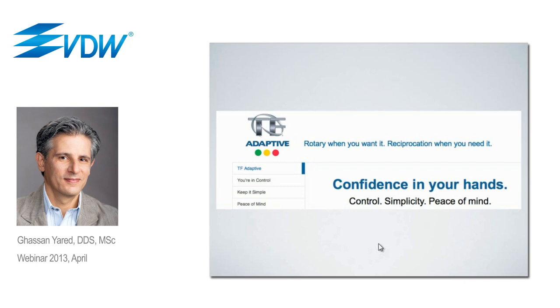But also, according to Sybron, in this system, reciprocation is used when needed. What does that mean? That means in the difficult cases, in the curved canals where there is stress on the instrument, reciprocation is needed. And this, in a way, proves the concept, the efficiency, and the rationale of single file reciprocation.